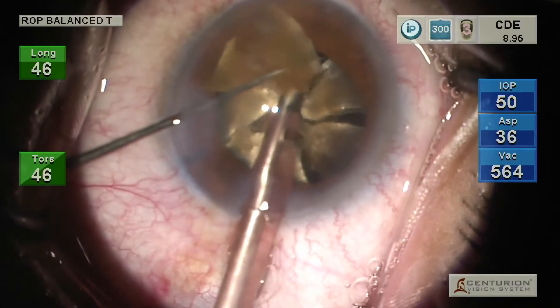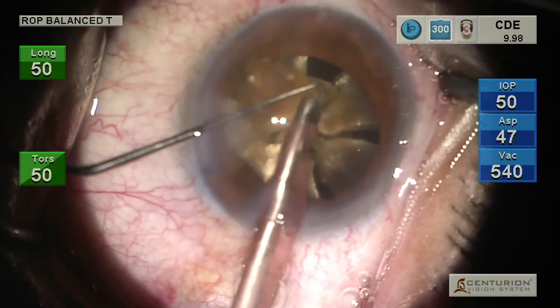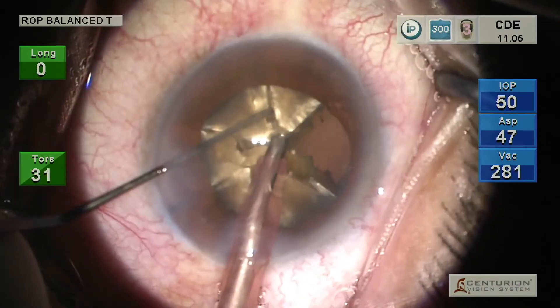During each fragment emulsification, the chopper is placed between the phaco needle and the posterior surface of the cornea, creating a mechanical barrier between the nuclear fragments and the corneal endothelium.